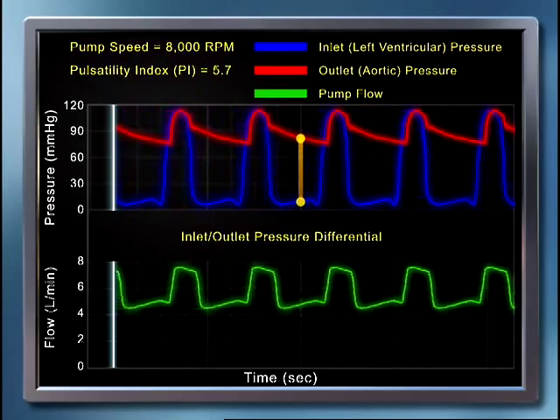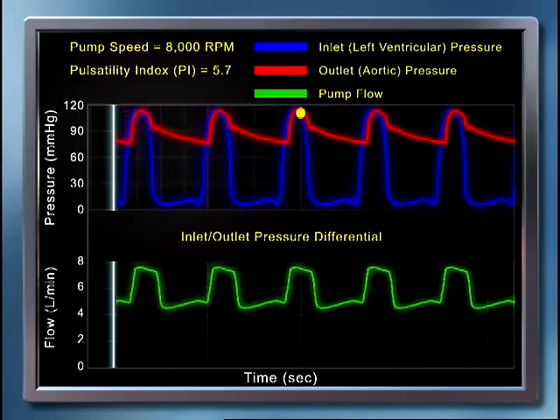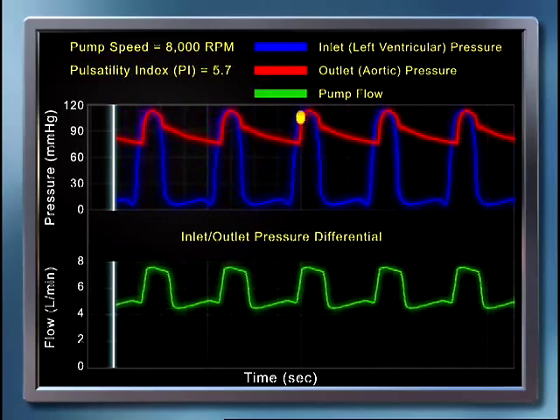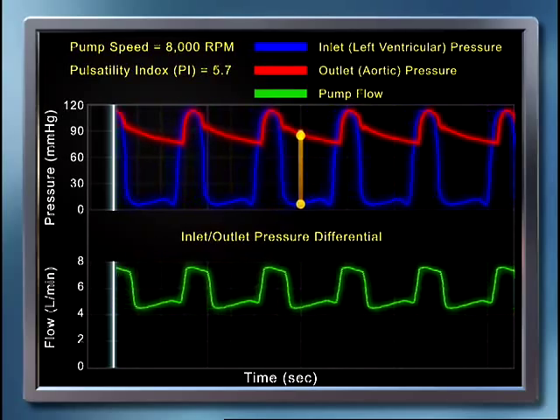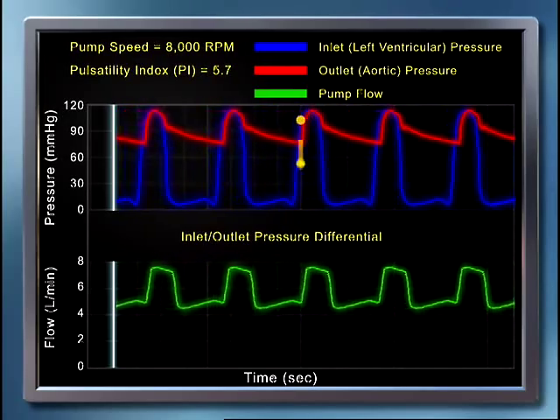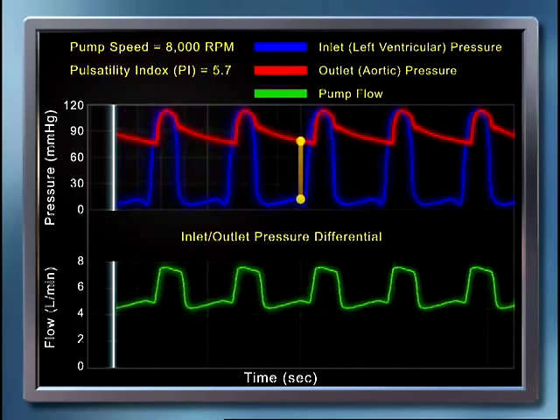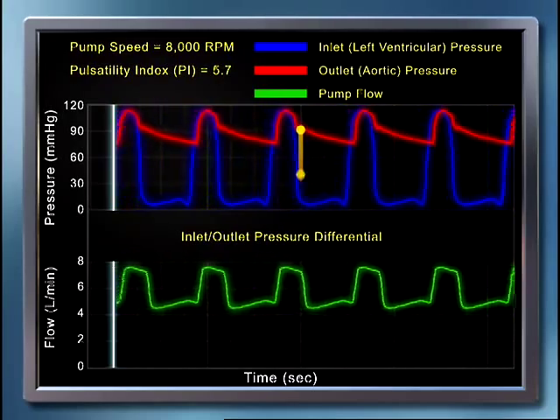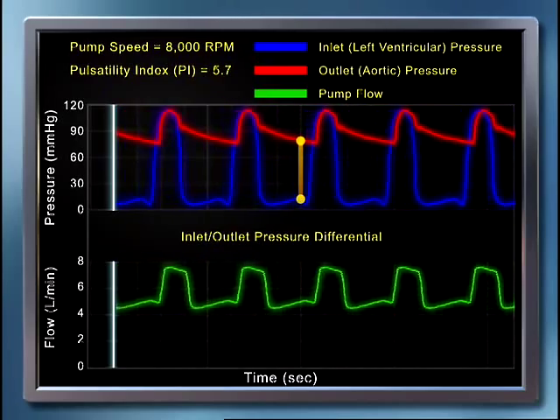The reverse is true during diastole at the same pump speed, where the blue waveform — inlet pressure — and red waveform — outlet pressure — separate, shown by the yellow bar becoming taller. When this occurs, the differential pressure rises, and the pump must overcome this increased pressure difference between LV and aortic pressure in order to propel blood forward, and therefore flow decreases.